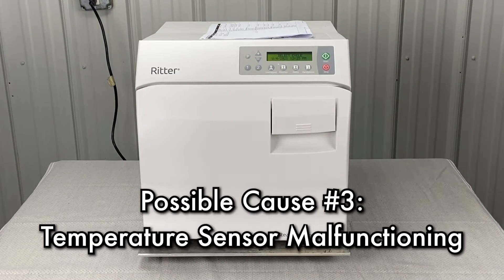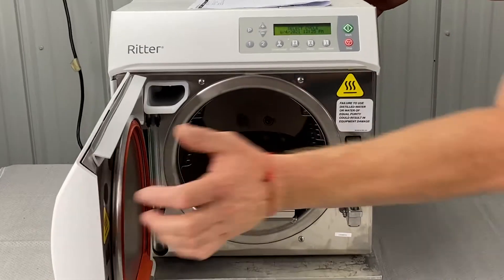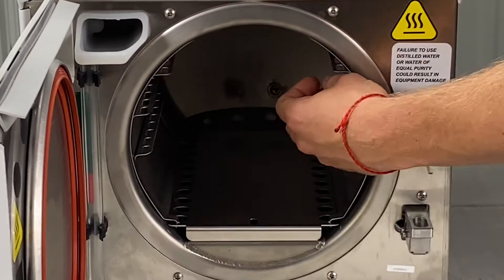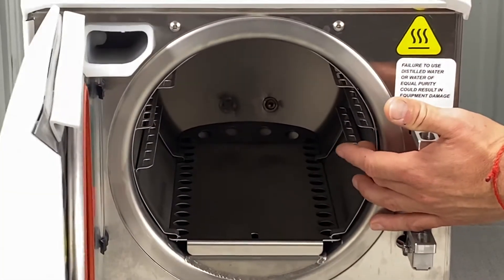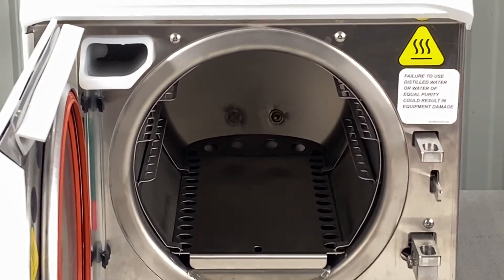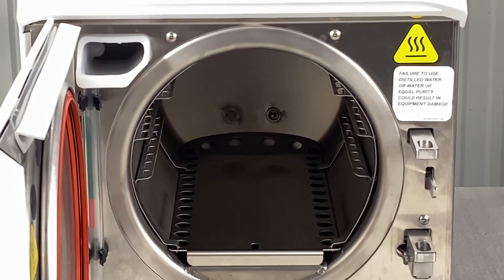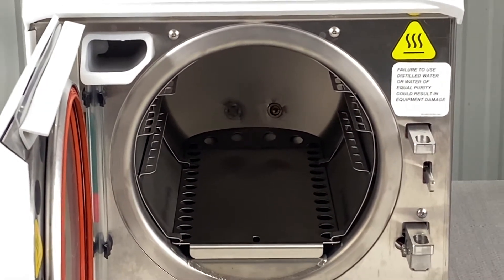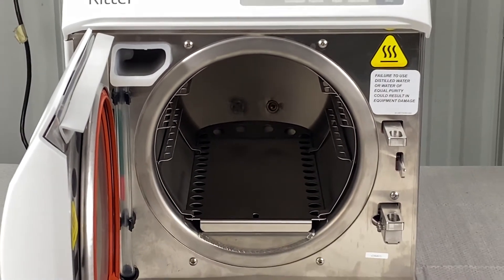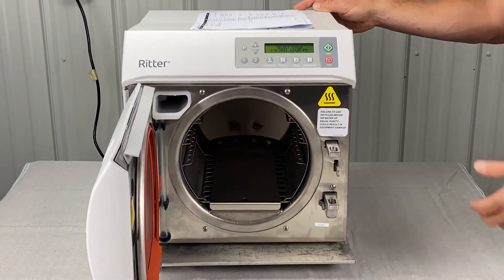Next, we're going to look at temp sensors possibly malfunctioning. Open the door and pull all the instruments and trays out. In the back, there's a temperature probe right in the middle of the chamber. Clean that with an abrasive pad, speed clean, and distilled water, then wipe it dry. Check that nothing is touching or crowding it.